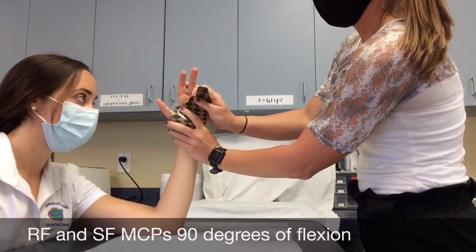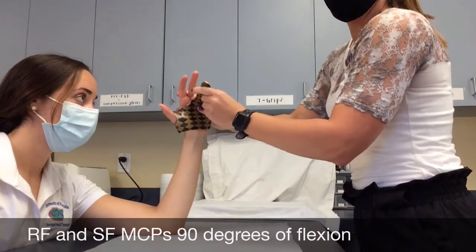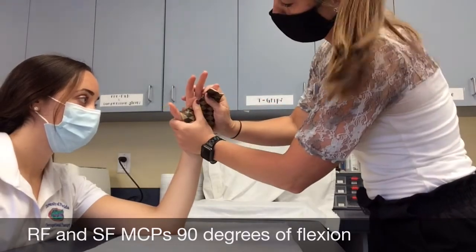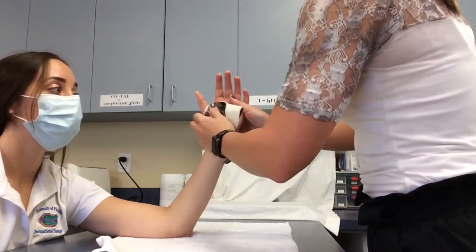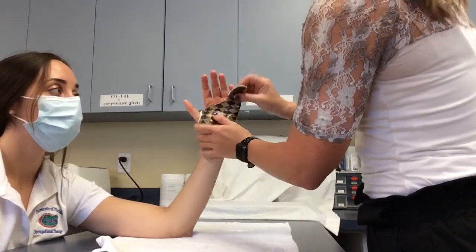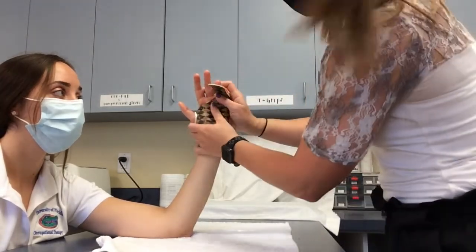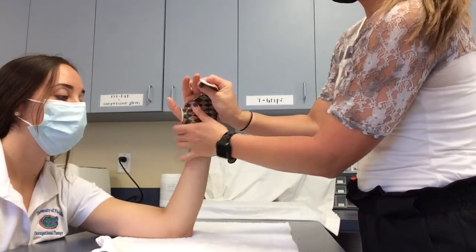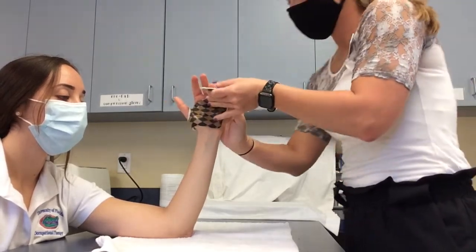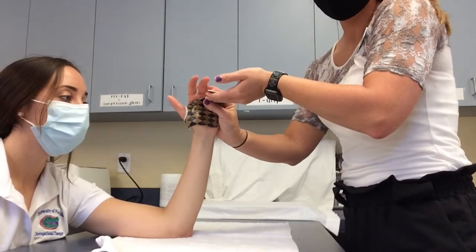Next, hold this position to let the material dry, while also making sure there is enough space on the ulnar aspect of the small finger for support. This may take you a couple of trials to ensure that it fits properly and to make sure that the patient is in the proper position. The material should also clear the long finger so the patient is able to flex both the index and long finger during the day.